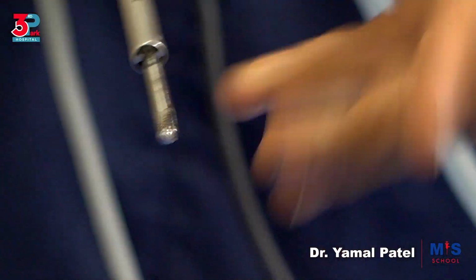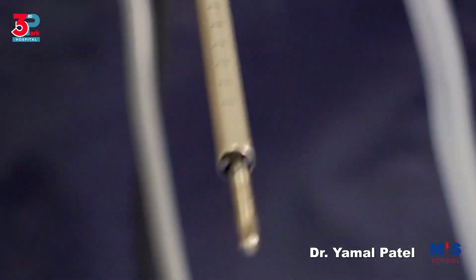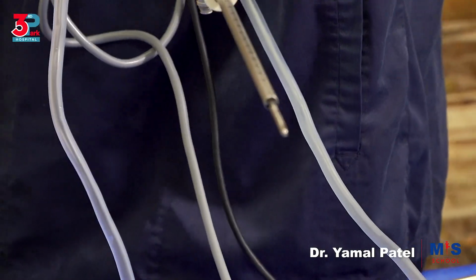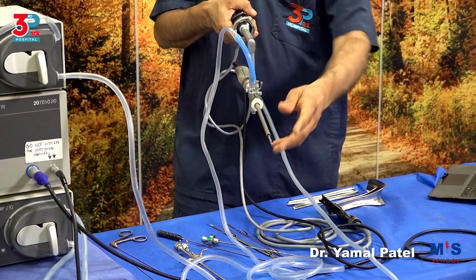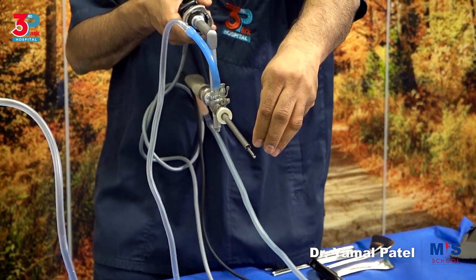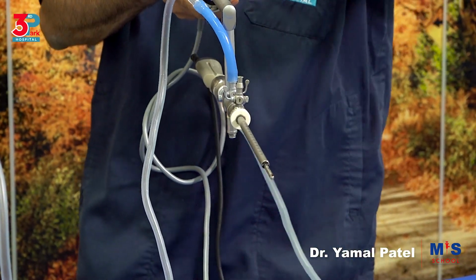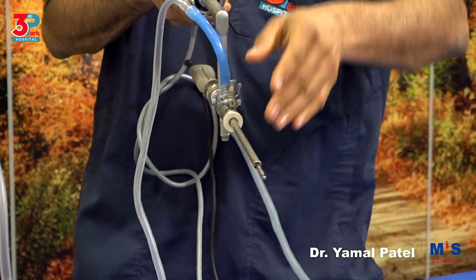And this is connected to the suction tubing, where now it is actually pulling the tissue back into the bottle where you can get a histology sample from. So this exerts a suction effect and pulls the pathology into the blade as it keeps on shaving it off by rotating and the blade going in that fashion.